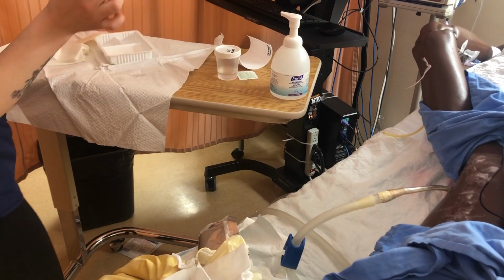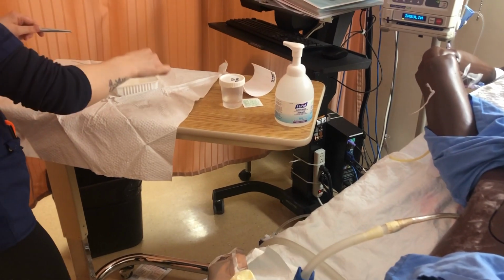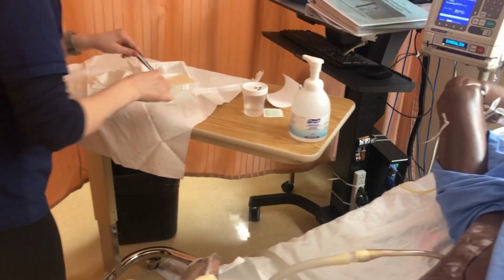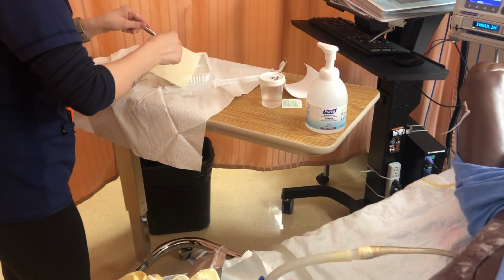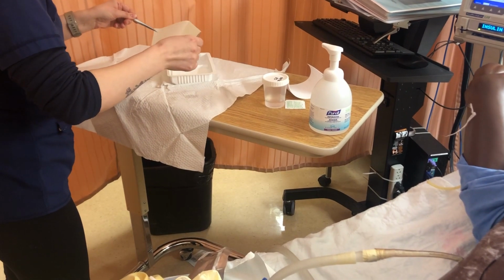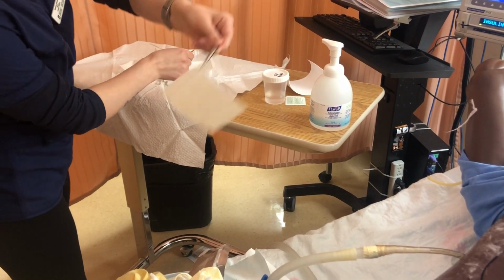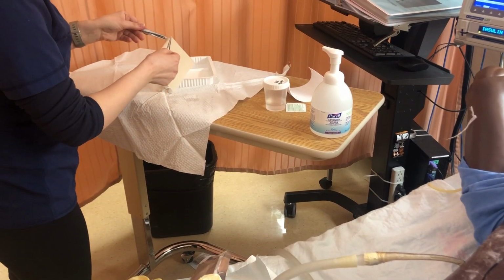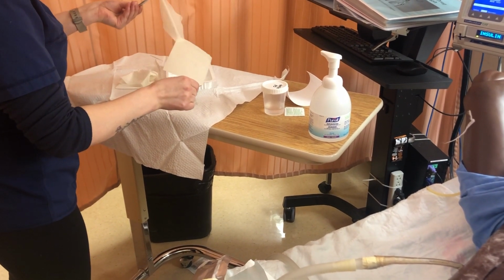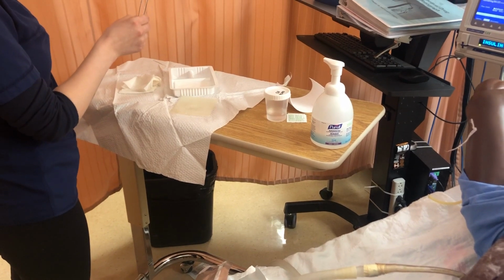And so now I need to put on my Jelonet. And this comes between two pieces of paper there, so this can be garbage. All right, got my Jelonet.